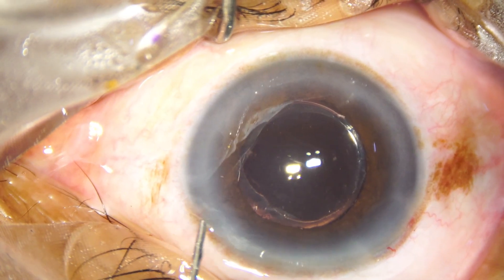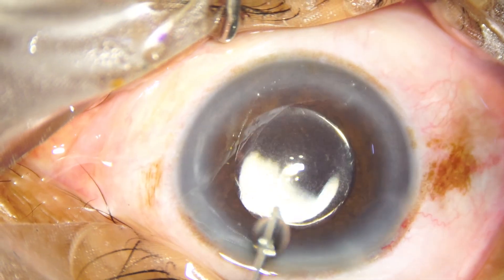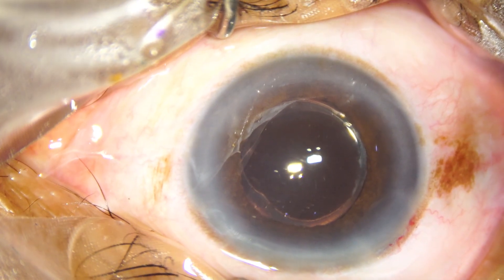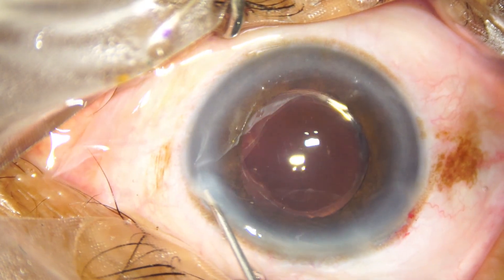It is very important. I have seen many eyes where part of the iris is incarcerated in the wound, and this should not be our practice.